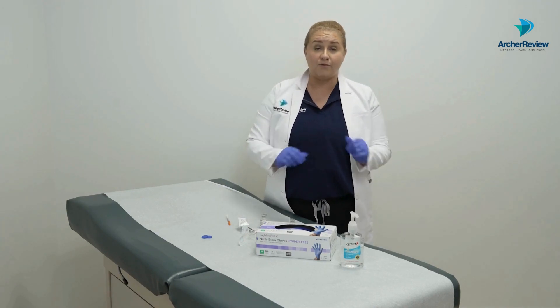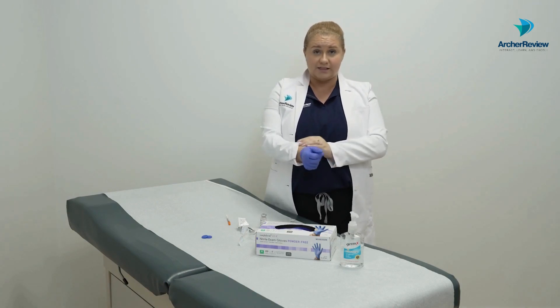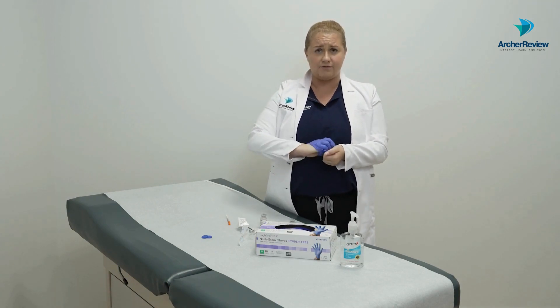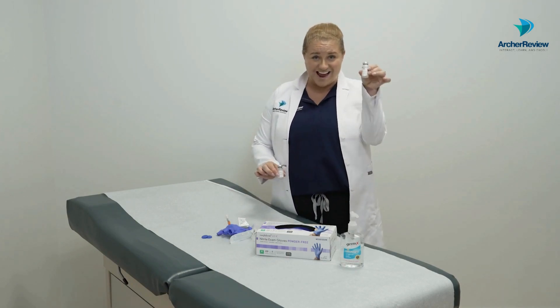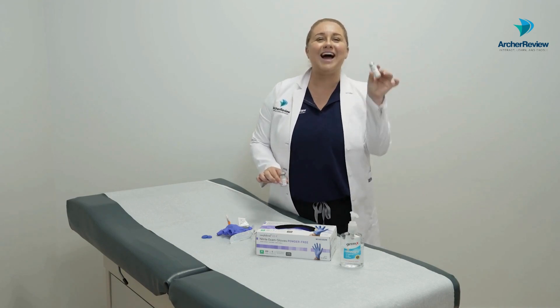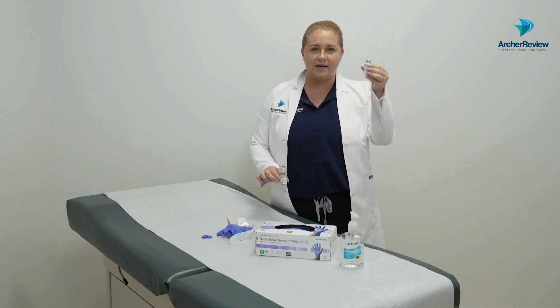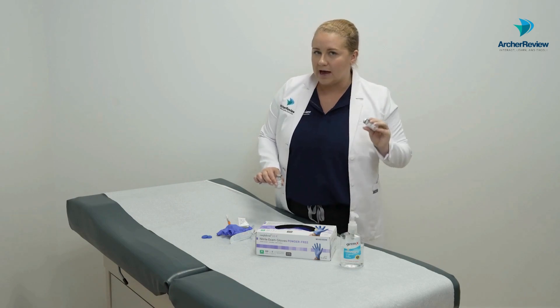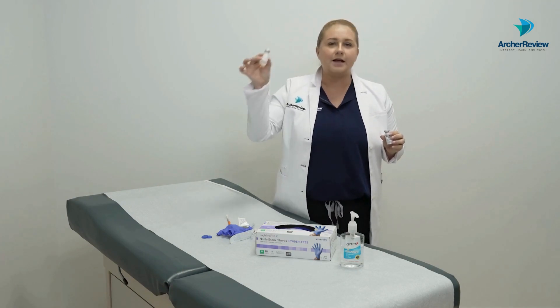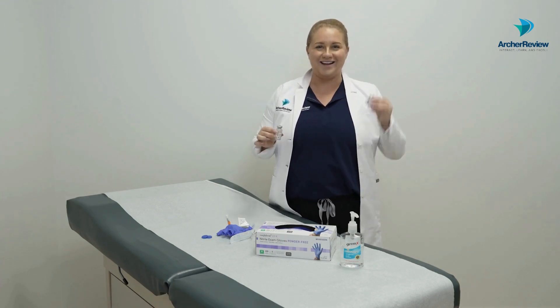One more quick tip before we finish: we always check the quality and expiration date on our insulins — these are very sensitive. All insulin should look clear except for NPH, which looks cloudy because of the particulates that help it last longer as an intermediate-acting insulin. So when you check your NPH before drawing it up, it should be cloudy; when you check your regular, it should be clear. A helpful memory trick: draw up the clear first, then the cloudy — regular, then NPH.